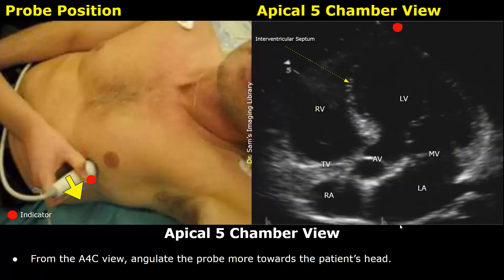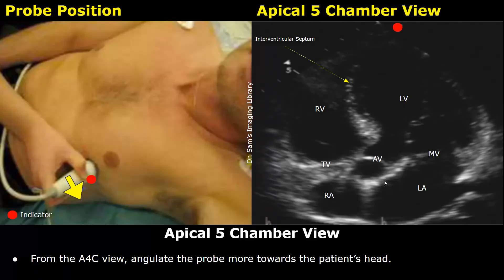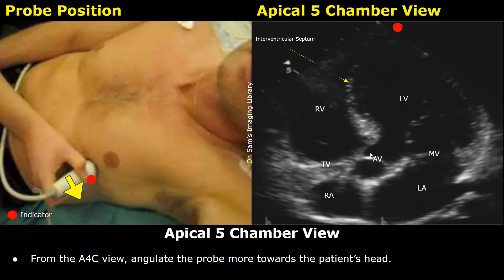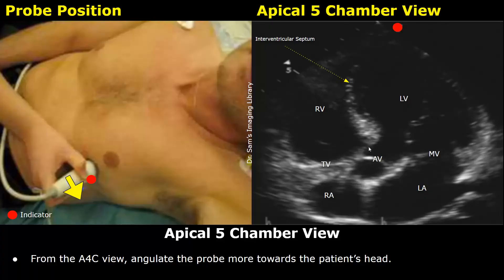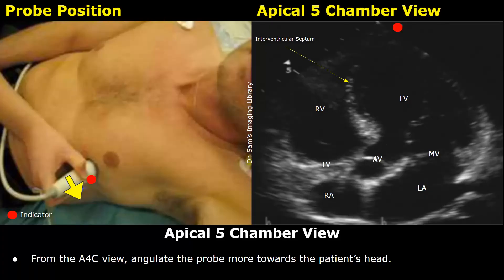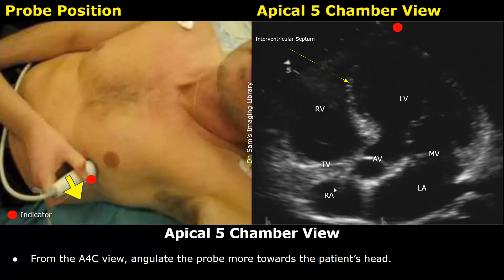From the four-chamber view, angulate the probe more towards the patient's head to get the apical five-chamber view. This view shows the aortic root and the aortic valve in addition to the four heart chambers.